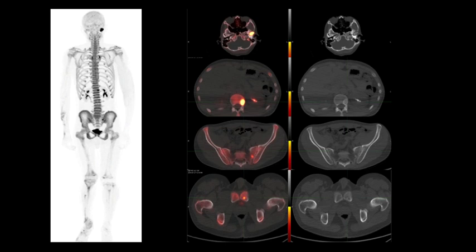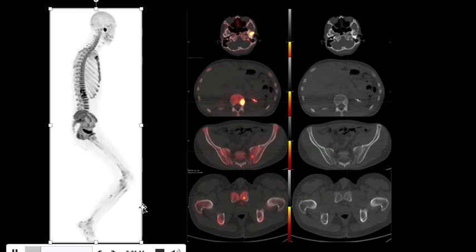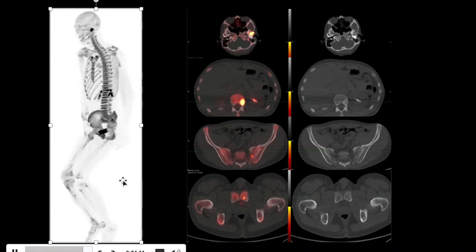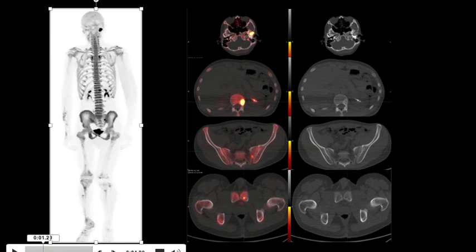Hi, this is Piyush Bhargava and I have an interesting case to share with you. We are looking at multiple images from a patient with history of osteosarcoma. Let's start by reviewing the whole body rotating image. This patient had a sodium fluoride PET CT scan and on this rotating image we find multiple foci of increased uptake.